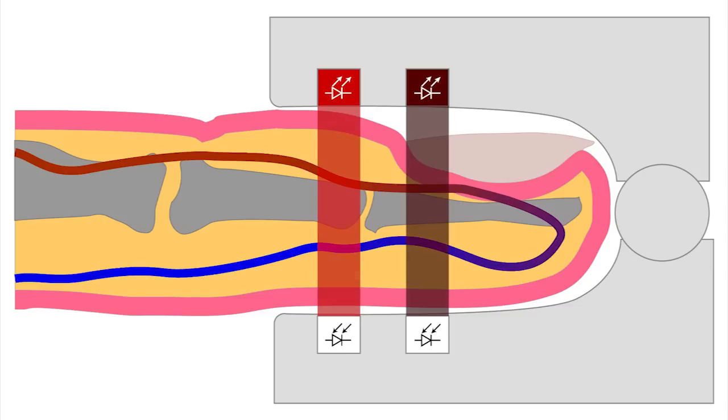So briefly, pulse oximetry is simply measuring the difference in the light that is emitted by an LED and that which is detected by a detector on the other side of a piece of tissue. It utilizes Beer's law to do so. And Beer's law, we know, helps us to describe the amount of light that's absorbed by a tissue.